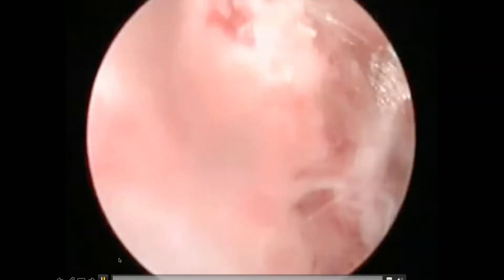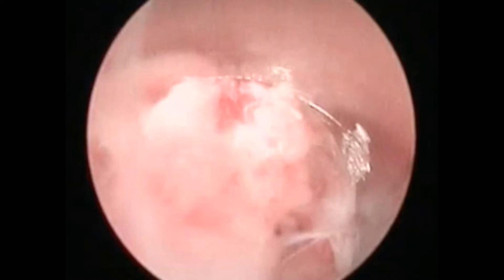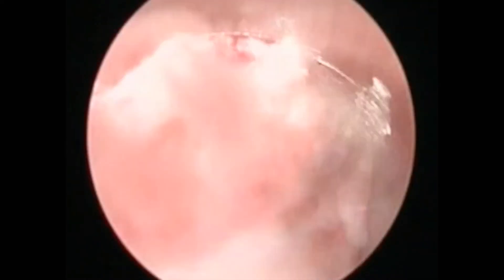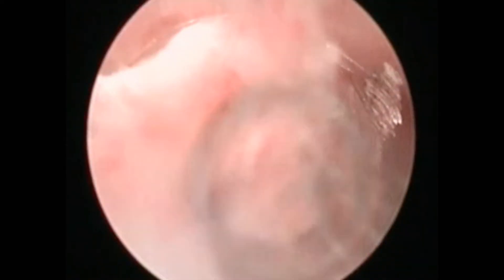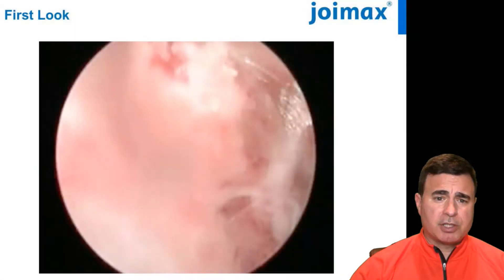Initially what you'll see is a big mass of tissue which may be disc material, it could be facet capsule, but there may also be nerve root underneath. One of the clinical pearls is that before you tug on anything, you squeeze with the graspers, because this will give the patient the opportunity to scream out in pain if you grab something you're not supposed to. This is one of the advantages of doing the procedure awake or under conscious sedation — if you're going to do anything to injure the nerve root, in general the patient will tell you.